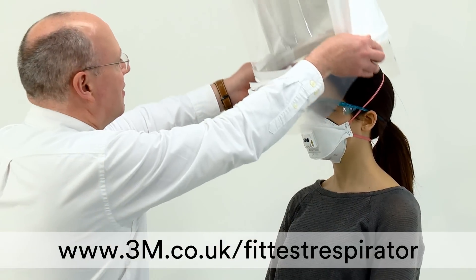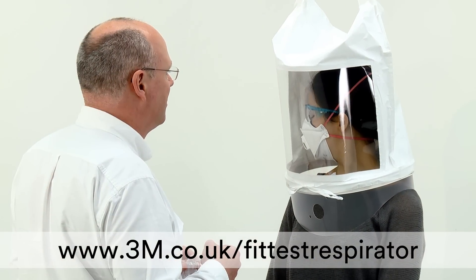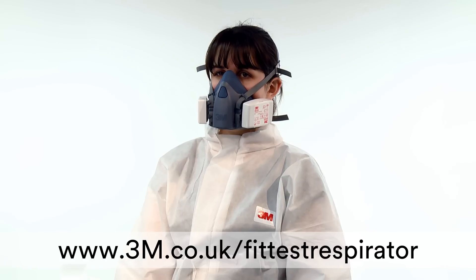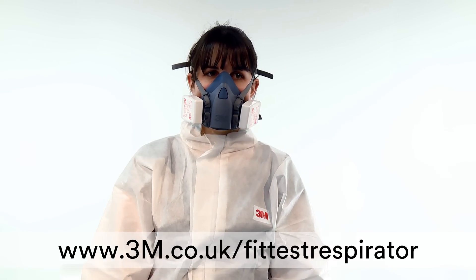Fit testing should not be confused with pre-use fit check, which should be conducted every time you use your respirator. For more information on fit testing, please visit www.3m.co.uk/fit-test-respirator.